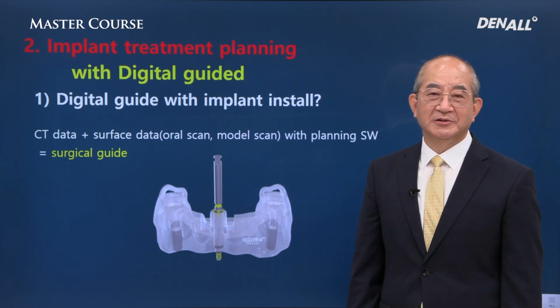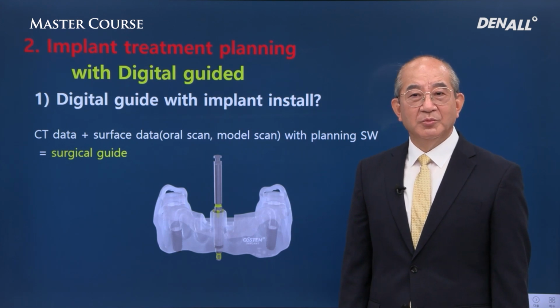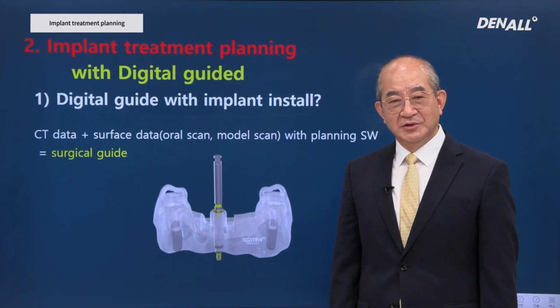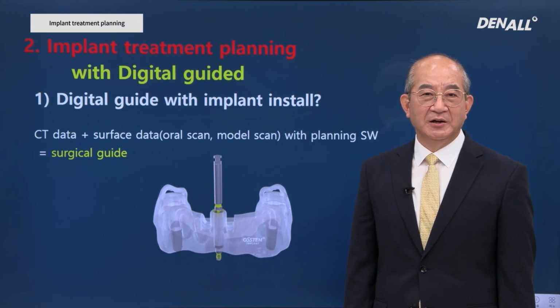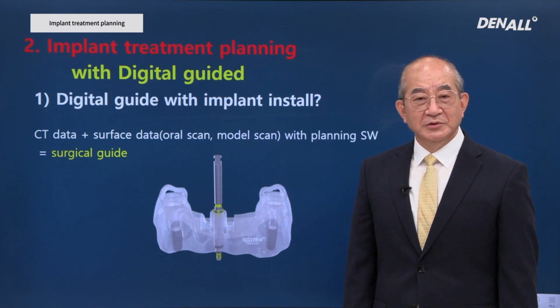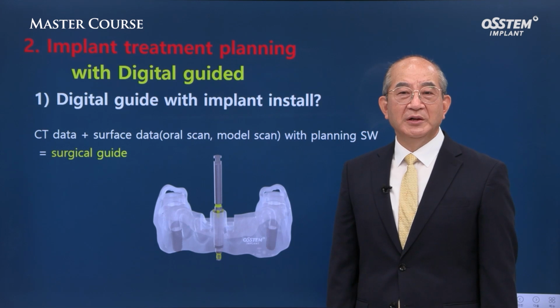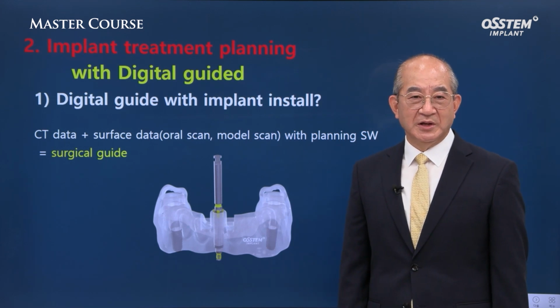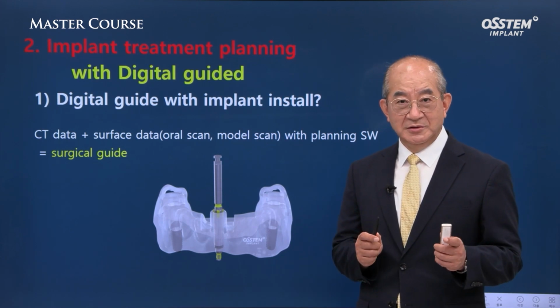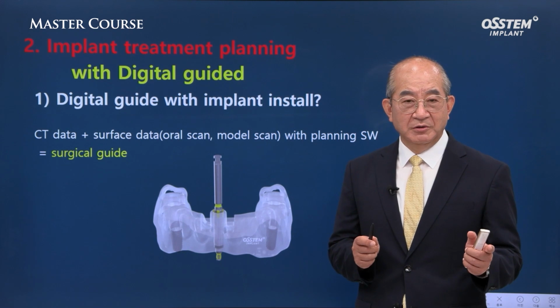This was quite a tedious job, and if fixatives or developers got on the gown, it would change color and look nasty. This was a cause of Monday blues for many hygienists and the staff working in dental clinics. For dentists, what was most uncomfortable was the lack of space to maintain the X-ray. These days, we take digital images, so there's no need for film and you can see it immediately. You do not need to develop the film.